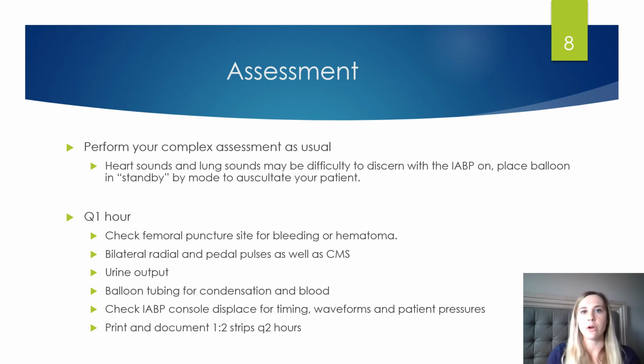After we do a thorough complex assessment of our patient, we're going to move on to the monitor and take a look at the intra-aortic balloon pump console. We're going to look at timing. We're going to look at our augmentation, different waveforms, different pressures that the patient's producing, as well as the machine producing. And the machine should be set up to print you a waveform every 2 hours, but we'll walk you through how to do that as well.